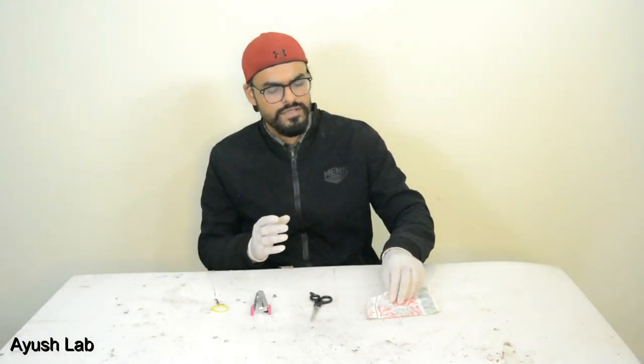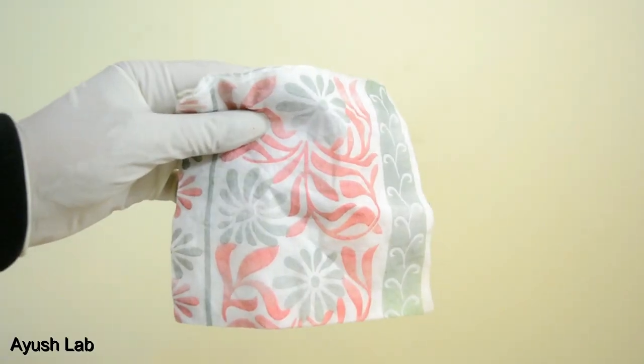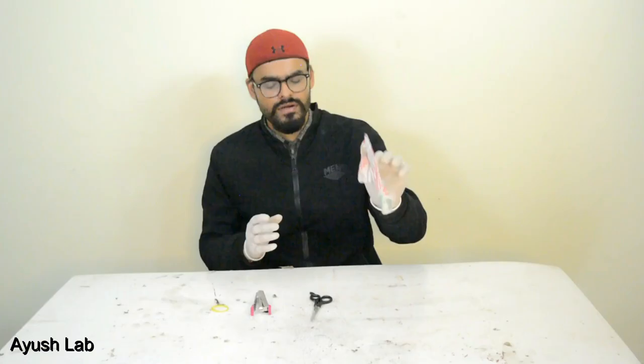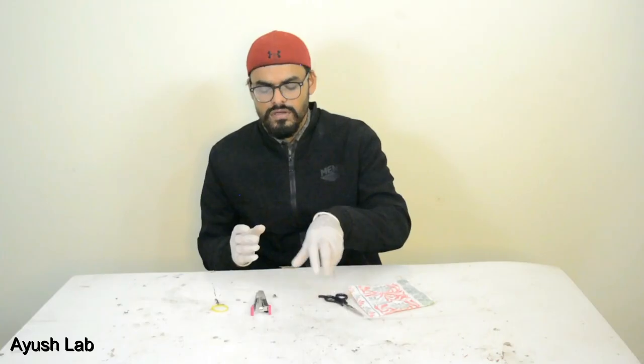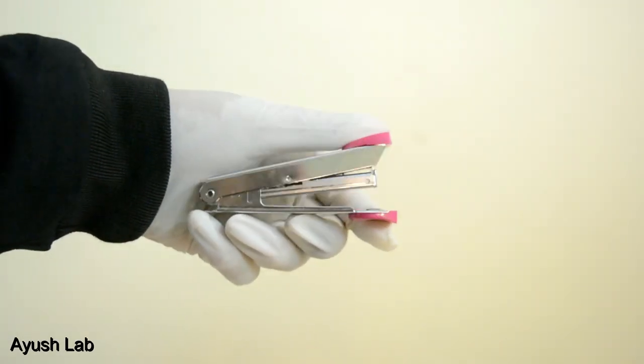I need tissue paper for the face mask. We are using tissue paper, scissors, a stapler, and two rubber bands.